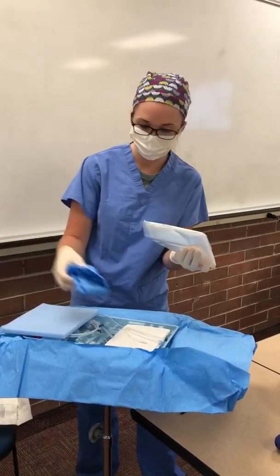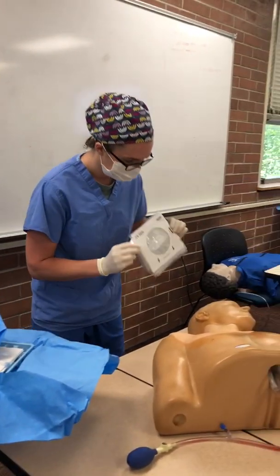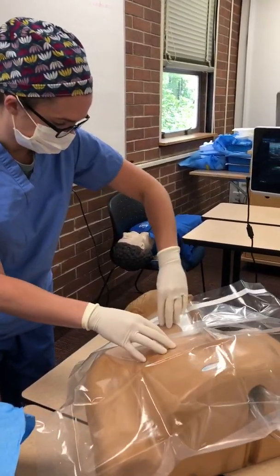Go ahead, now that he's nice and dry, it's been at least 2 minutes, I'm going to go ahead and drape him. So I peel this off, drop this right over that site, and open that drape up.